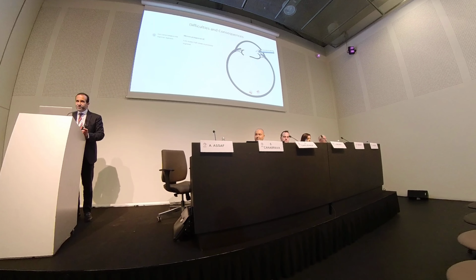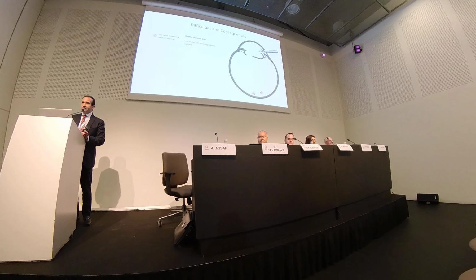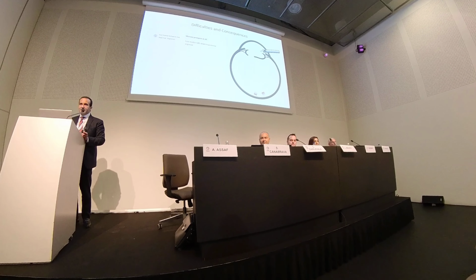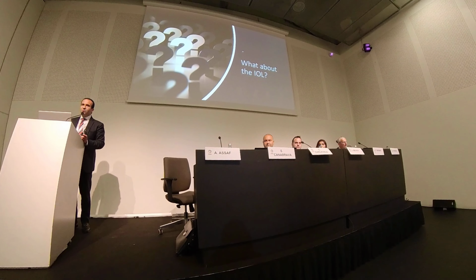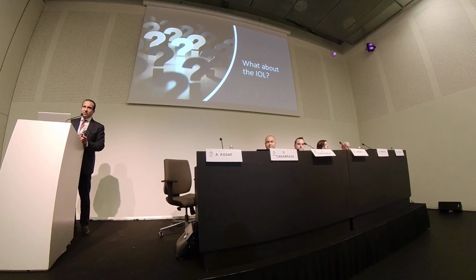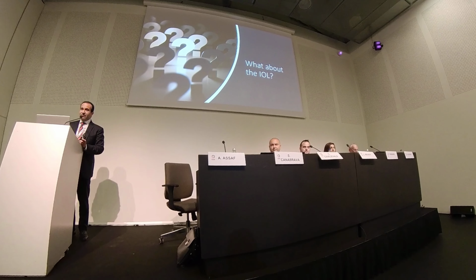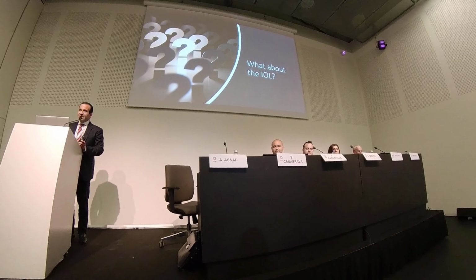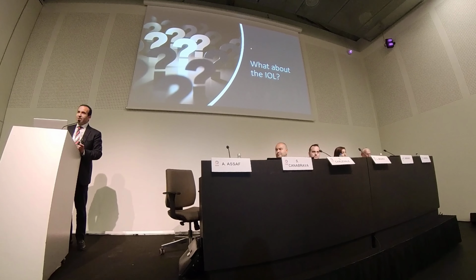Suppose that you just did a complete vitrectomy and you now have an open posterior capsule. What about the IOL? What are you going to do with the IOL? This is the aim of the course. So now it's not planned. This is the real life scenario. There is no plan, and you have just a routine phacoemulsification case, and it ends up with an open posterior capsule.